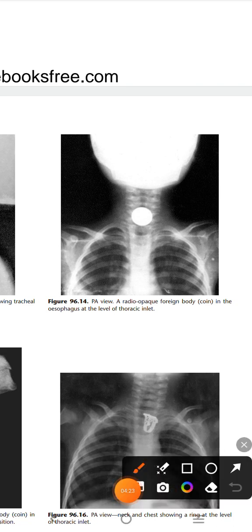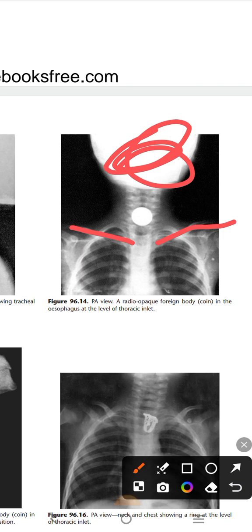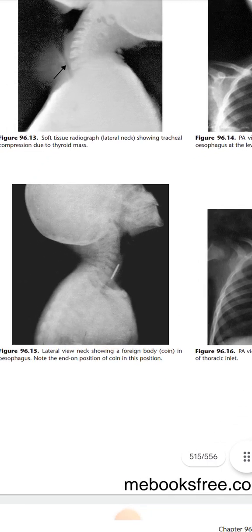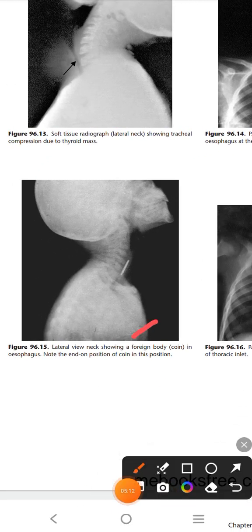This is the PA view — you can see from the clavicle and confirm there is no scapular shadow shown. A radio-opaque object is seen mainly at the level of the thoracic inlet, written here as present in the esophagus. However, you cannot say with certainty whether a foreign body is in the esophagus or airway from a PA view alone; you must also take a lateral view of the skull, head, and neck to confirm the location.